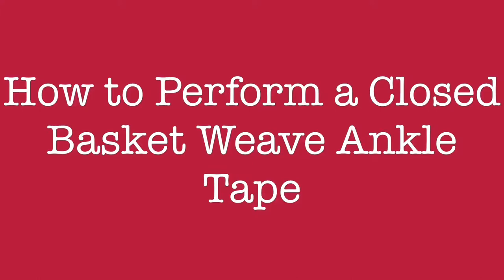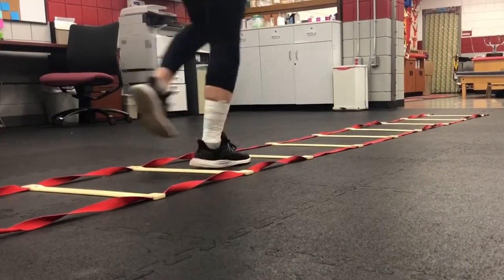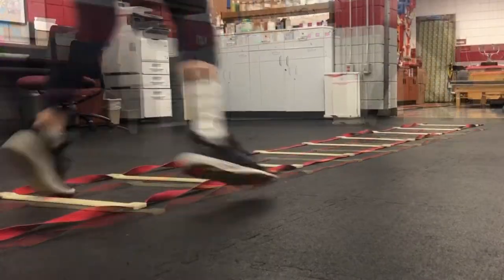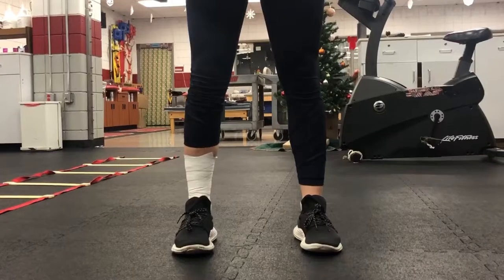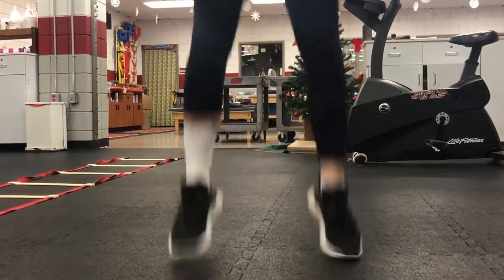In this video we will walk you through the steps of a closed basket weave ankle tape. Taping is used to reduce excessive range of motion without affecting the athlete's dynamic balance. There's also a biofeedback aspect to the taping which helps the athlete feel more supported when performing activity. Ankle taping increases stability but should always be used in conjunction with a rehab strengthening program.